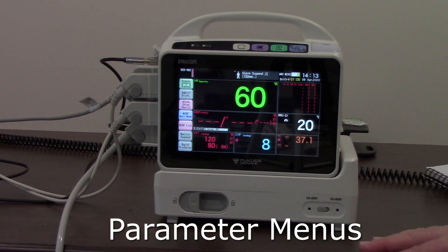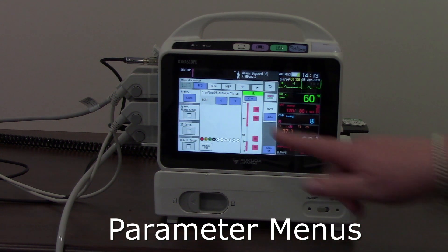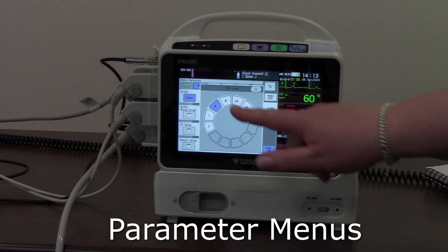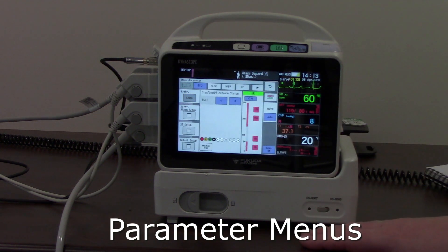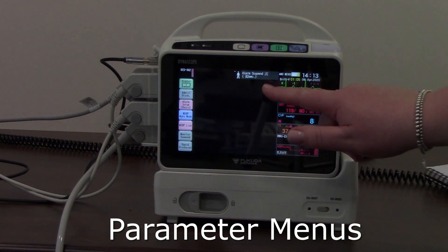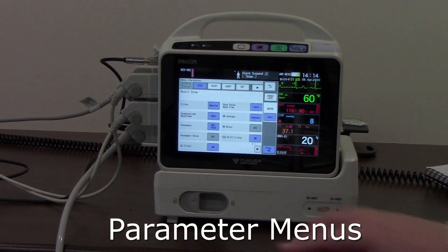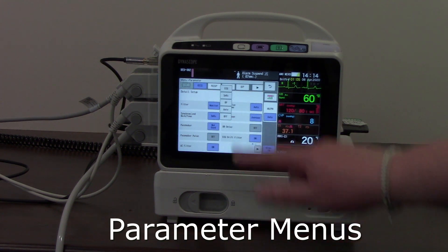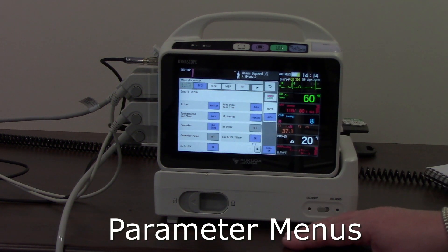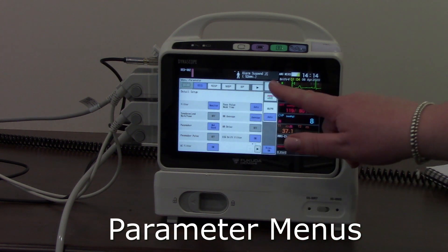Every single parameter is interactive. If I touch my heart rate parameter it brings up the heart rate menu, enabling me to change the size of the waveform or change the main monitoring lead. It will also allow me to look at my arrhythmia alarms from there. Going into the detail setup, I can set my beep tone — selecting auto turns the synchronized mark tone on, or I can turn it off if I don't want it making a noise.